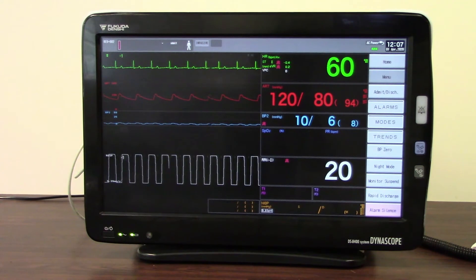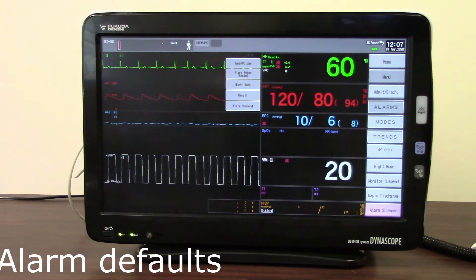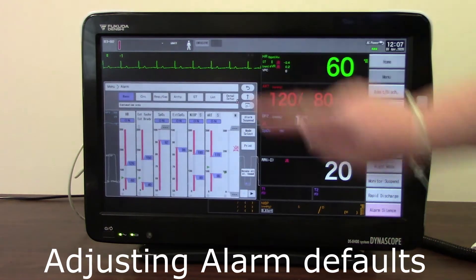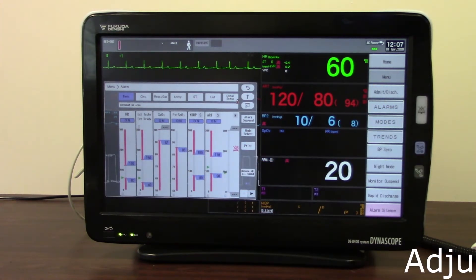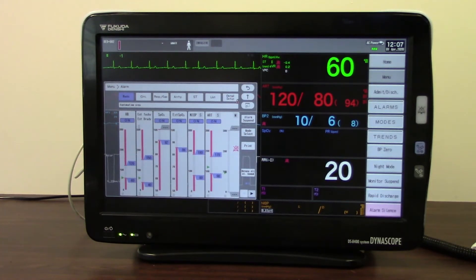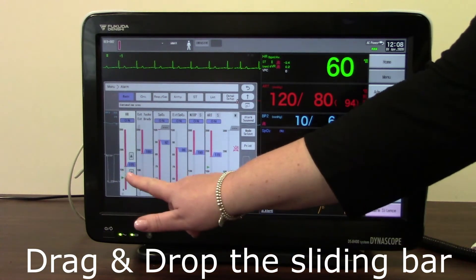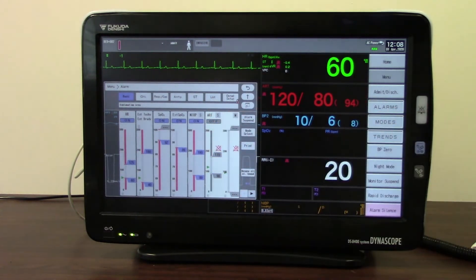To set your alarms there are a number of ways this can be done. I can go into the alarms menu or find it on one of my user keys. Here I've got my alarm setup basic display, which will show me all of my alarms that are available to set. You can see the little green arrows that show where my patient is currently at. To change any of these, I simply drag and drop to wherever I want that alarm setting to be, or touch and move it up and down using the arrow keys. I can also turn alarms on or off from this page.